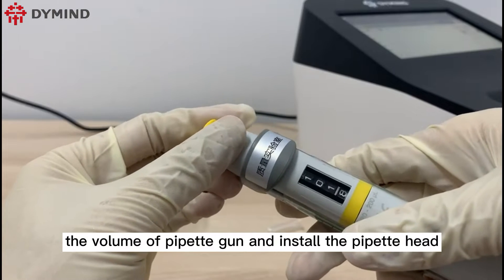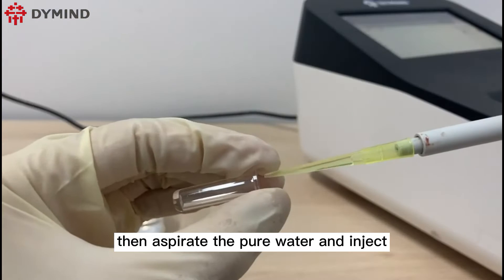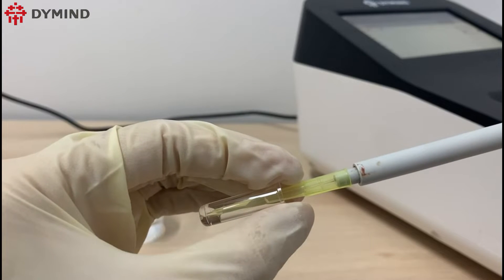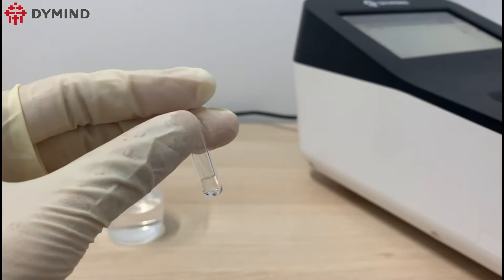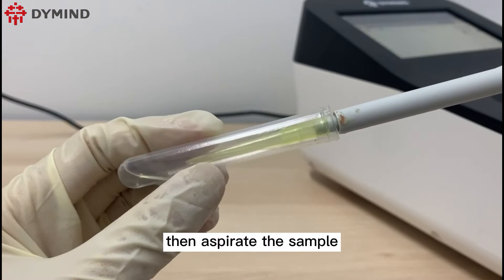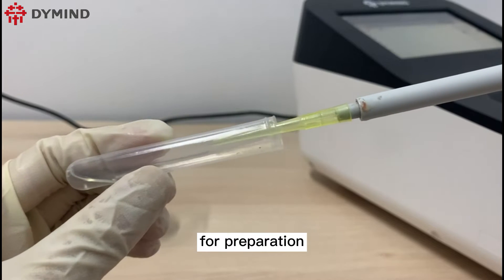Please adjust the volume of the pipette gun and install the pipette head, then aspirate the pure water and inject it into the optical reaction cup for preparation. Please note that the pipette head cannot touch the inner wall of the reaction cup. Adjust the volume again and install a new pipette head, then aspirate the sample and inject it into the optical reaction cup.